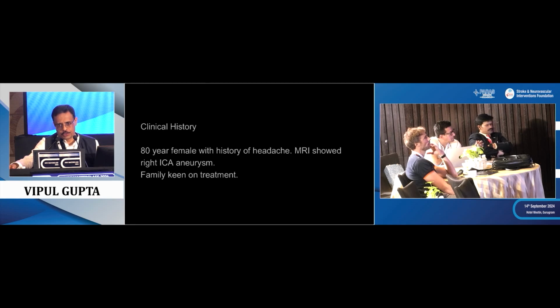These are high-risk procedures. So we just wanted to show some technical aspects: distal guiding, balloon in the vertebral, using the 10 wire. You don't want to push your 12 and 14 wires into this PICA. And during the delivery, you have to keep an eye on the distal wire going into a small branch. And whatever you do, you may still have a PVO or stent stenosis or arterial occlusion, either at follow-up or immediately. These are all to be kept in mind.